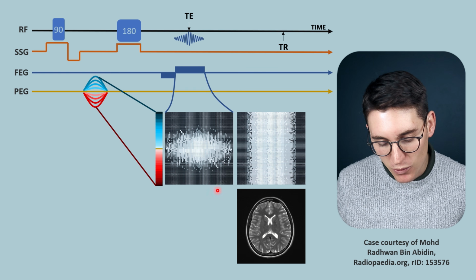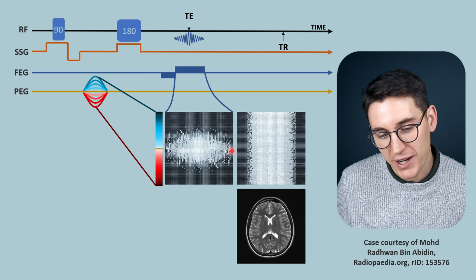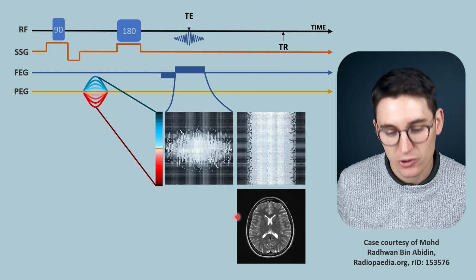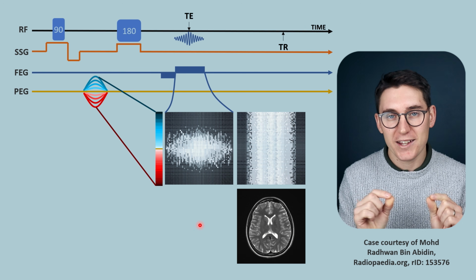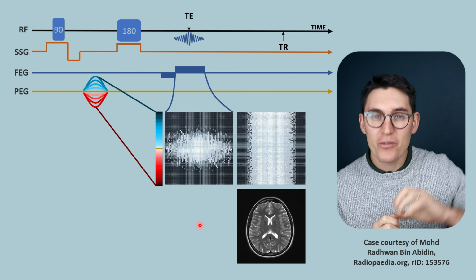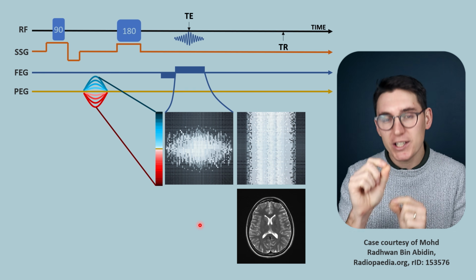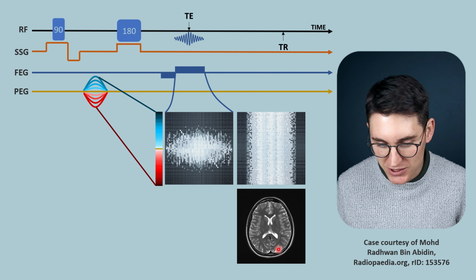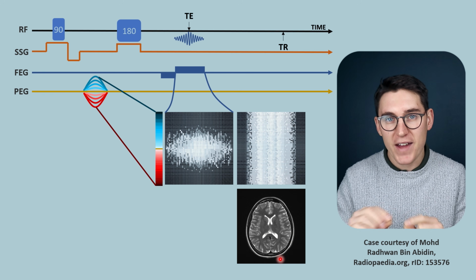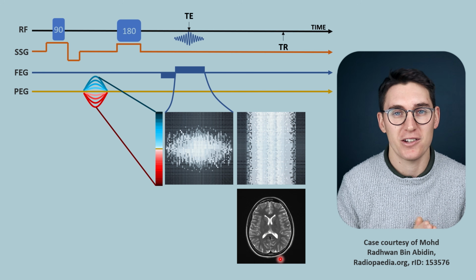Now I want to take you through a very basic process that is going to show you how we can combine these data sets in order to create this image. Now the way that we're going to describe this is a much more simplified version of the actual process that is happening in the background. We are going to take only 2 data points along a specific x-axis location, when in fact often we're using 256 different data points and comparing them to one another.